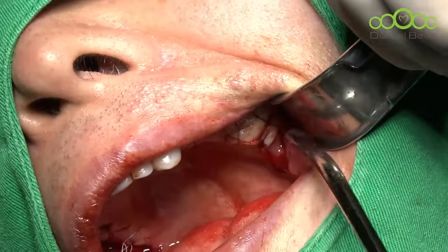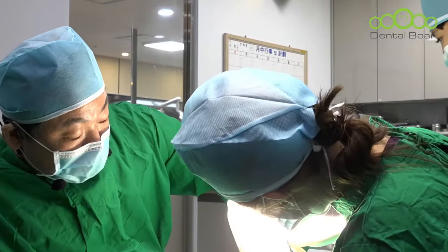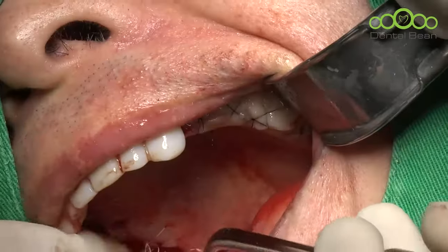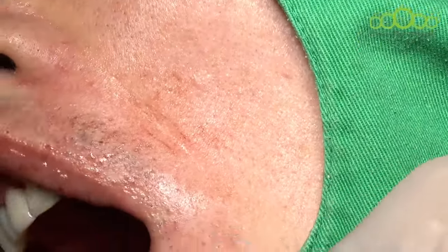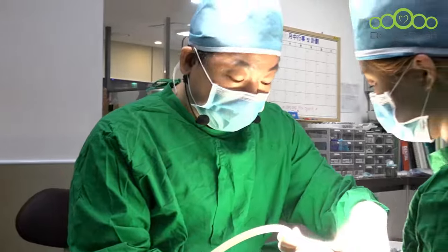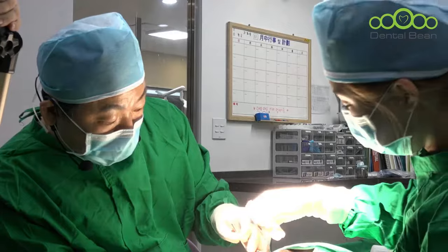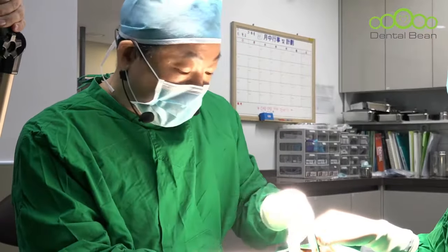Okay, let's close. Oh, I over the 5 minutes. No need. Okay, I spent 1 hour and 5 minutes, slightly delayed. Unexpected situation at premolar side, so it happened. Well, everything finished. Okay, let me check. Here and here. Okay, next, close, please. Okay, now we can see sufficient vertical space at maxillary tuberosity.